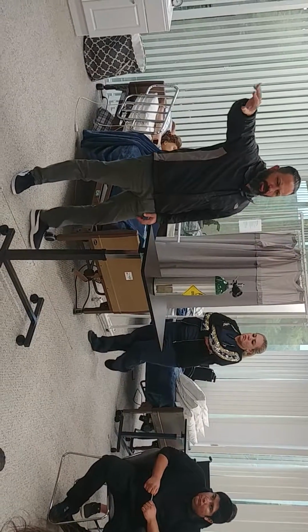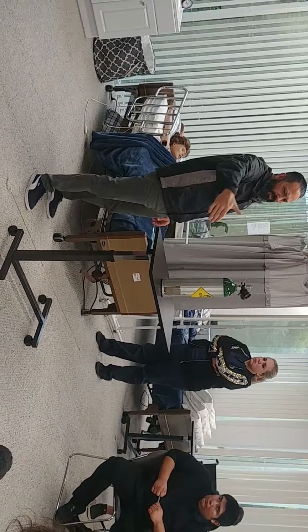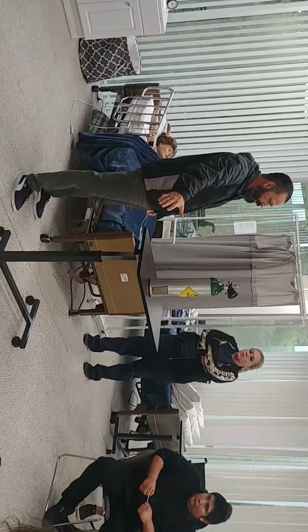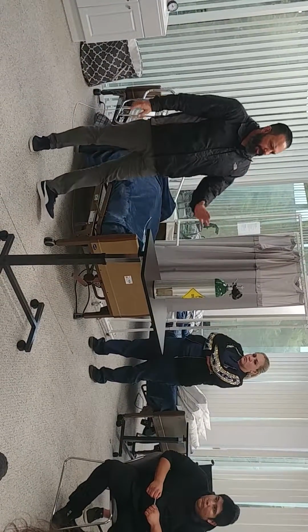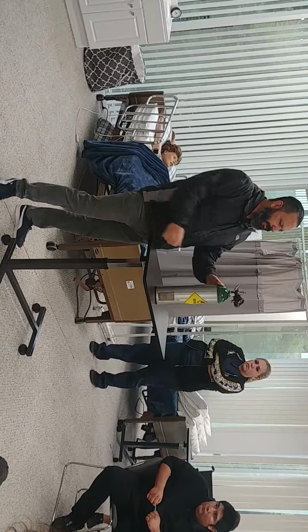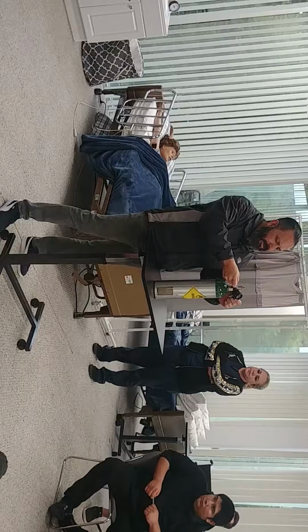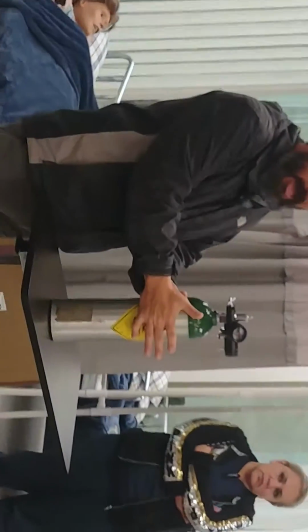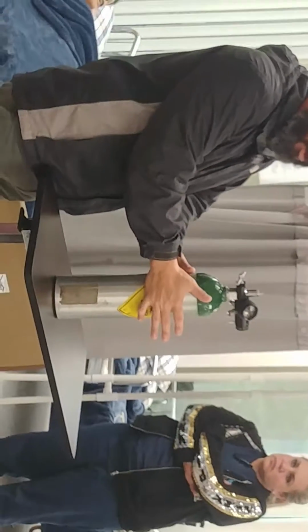I have an extra cylinder in there, so when you do the skill, you're going to take the regulator off one and put it onto the other. First, just like anything else, we need to know our equipment before we use it. So we have the bottle itself. Please know again that it is a hazardous material, and these need to be stored correctly.